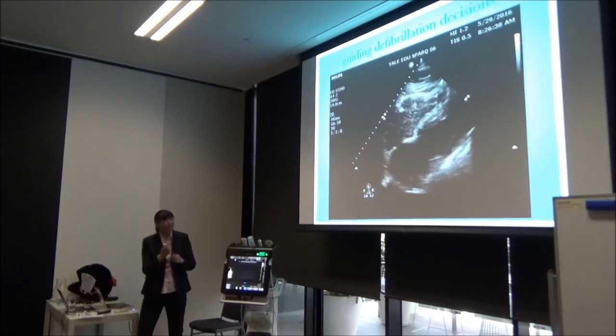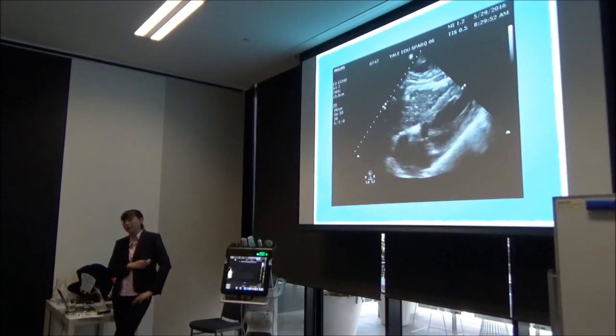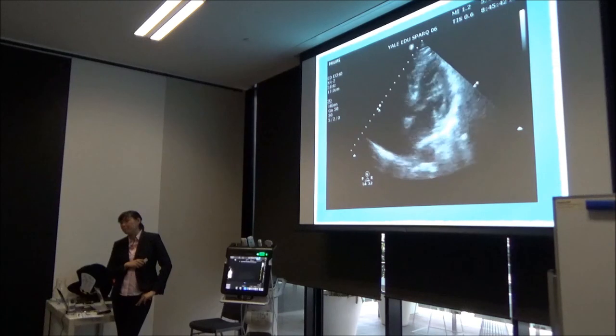Okay. And then this is a series of ROSC after this person got shocked. This is final ROSC after 15 minutes of this arrest period.